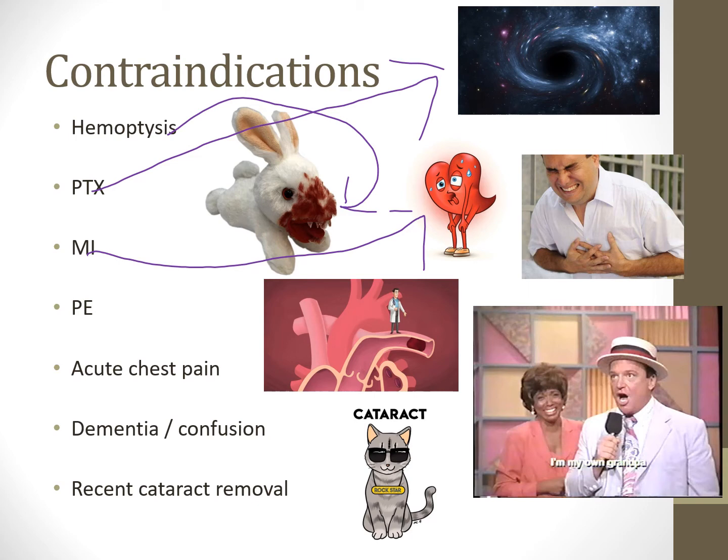The lungs mostly go through the stress in this situation. So if the patient's had a recent MI, you probably should hold off until the physician approves it. Now, if a physician approves it, then you should be good to go. But if they had an MI within the past week and a physician hasn't approved the test, we should get approval before moving on with that test.